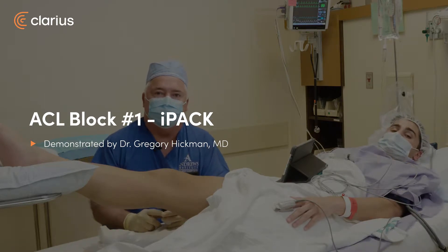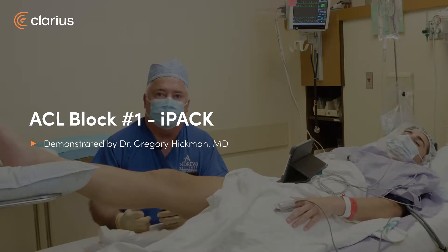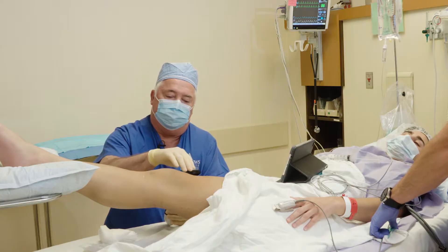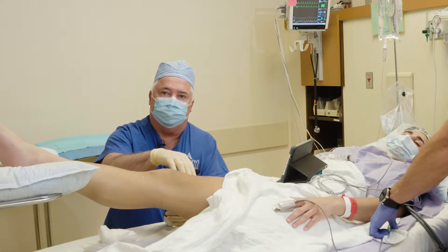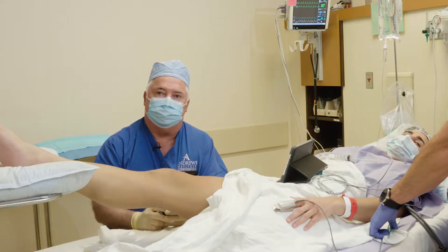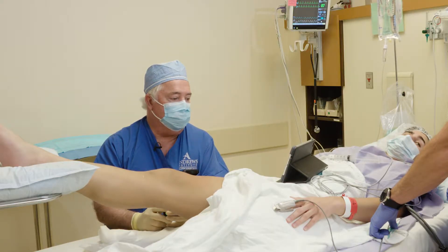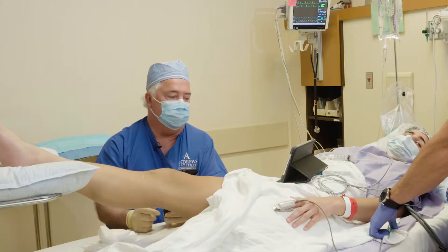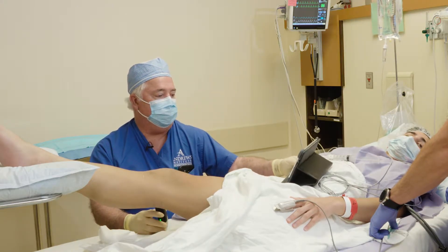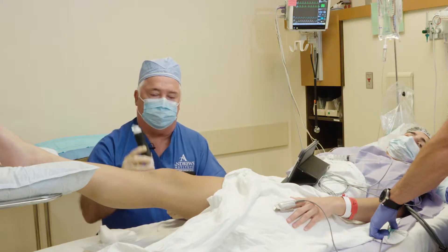We've got a young man for an ACL today. This is Dr. Greg Hickman from the Andrews Institute. For the ACL, we're going to start with an IPAC injection, then do a superior lateral genicular injection, then put an adductor canal catheter in using our Clarius Wi-Fi ultrasound probe along with our mini iPad as our screen to see what we're doing with this wireless ultrasound.